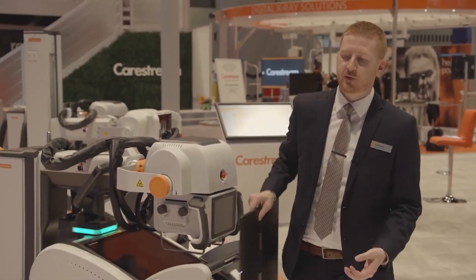CareStream has the ideal solution for making your mobile rounds go quicker with less stress and strain on your radiographers: our DRX Revolution paired with our new LUX35 detector.